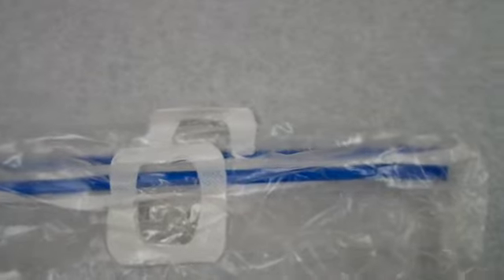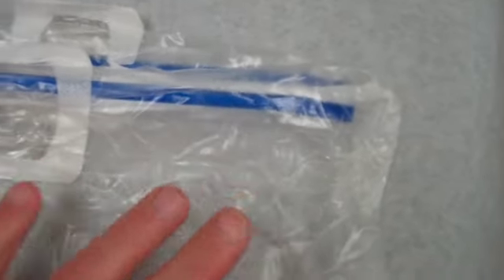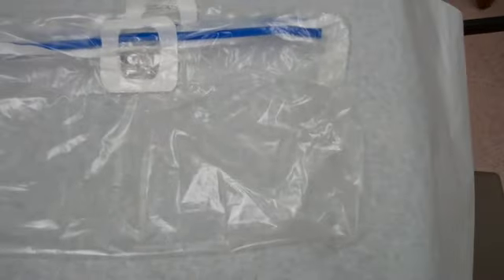Okay, so this is the LI Endofield version 4. A couple of minor changes. So basically, here's the basic bag, and this goes intra-abdominally and covers like the entire pelvis and the abdomen. This is the 8-inch bag. This is good for most patients.